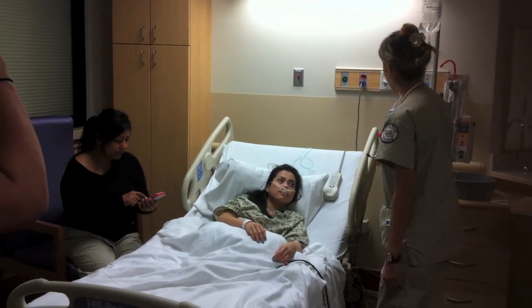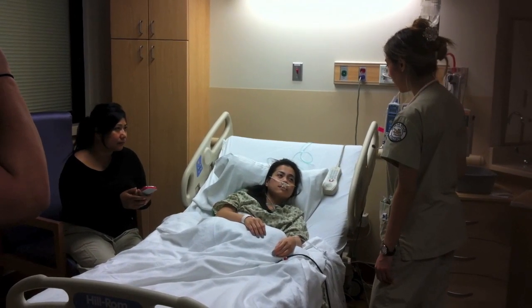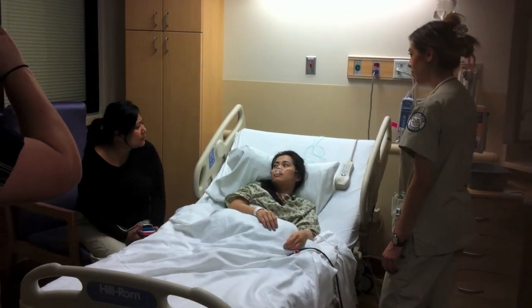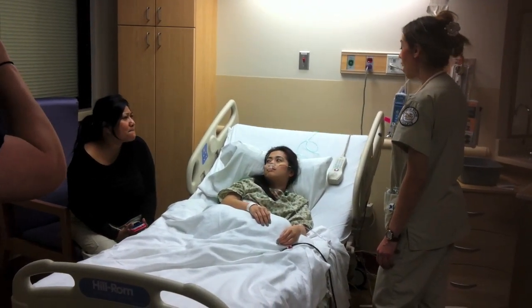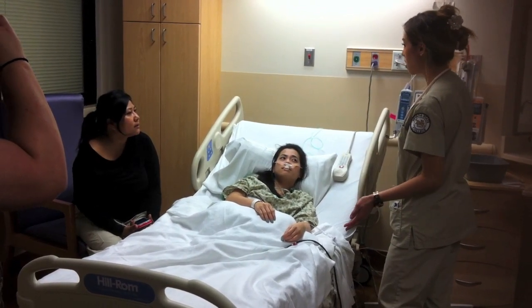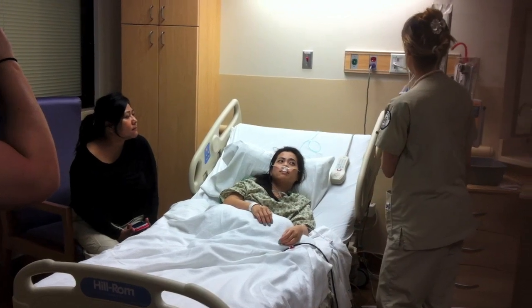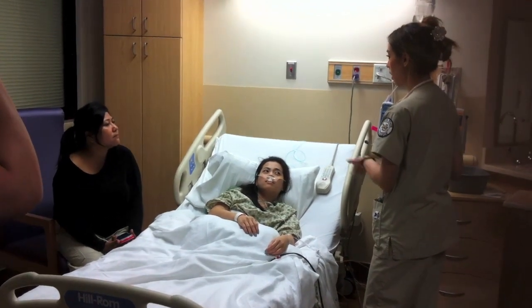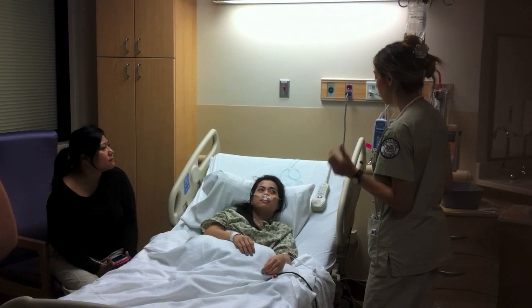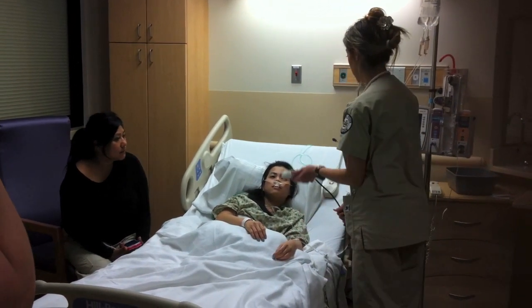I'm your nurse for today. I'm going to be giving you a PCA pump to help control your pain. A PCA means patient controlled analgesic pump. It'll be running a continuous infusion — you'll be getting medication little by little for your pain, and if you feel like you need additional pain medication, you can push this button.